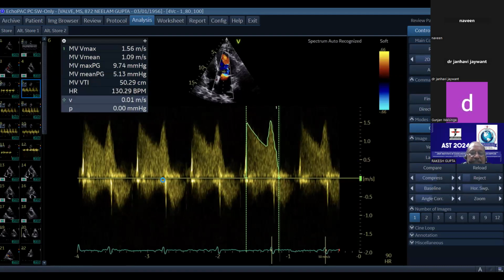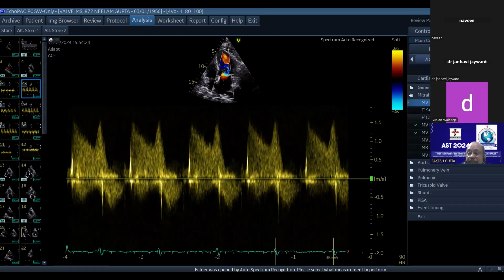His question is, when we have a stroke volume across this mitral valve, normally what happens is E comes down to baseline and then A comes up. Correct? Yes, that was your question. So normally you have to trace this. If I have to trace this over here, give me a second, I'll trace it for you.